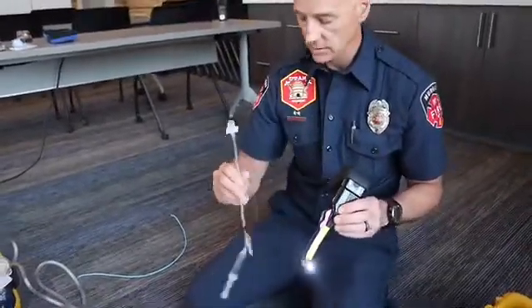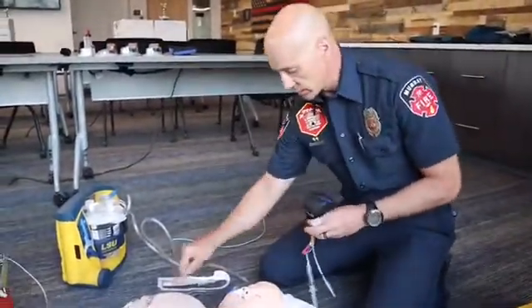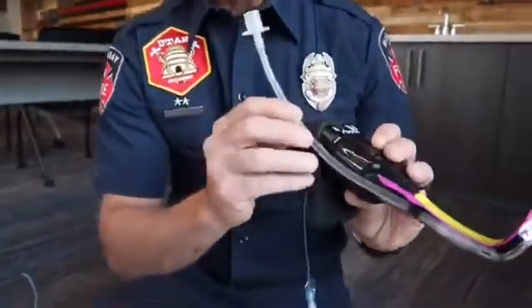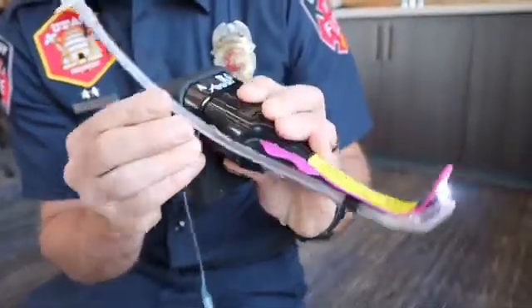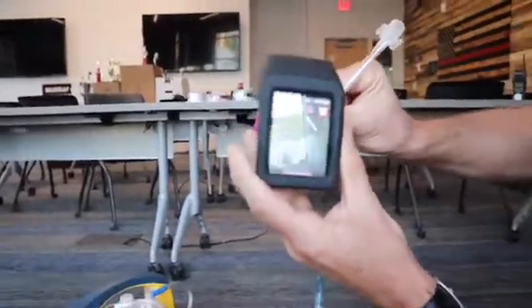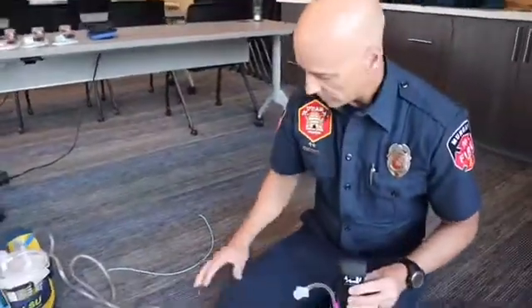The endotracheal tube has to slide into the channel on the blade, and to do that it needs some lubrication. Put some KY jelly inside the packaging where the blade came out, then lubricate the distal end of the tube. The ET tube then inserts into the track — advance it until it's just about to the tip of the clear plastic. You can see it just in the corner of the frame. You don't want to push it too far as it will obstruct your view of the cords, so back it up until it's just barely visible in the frame.